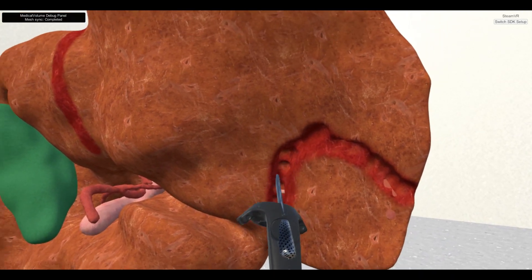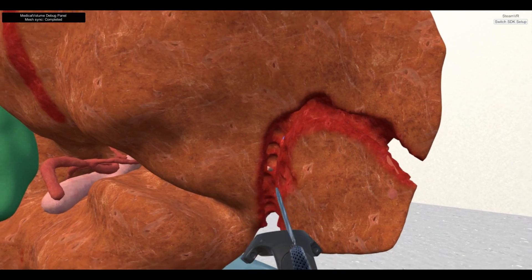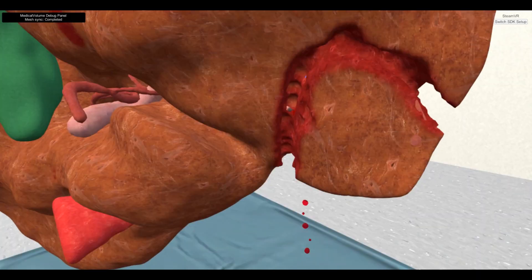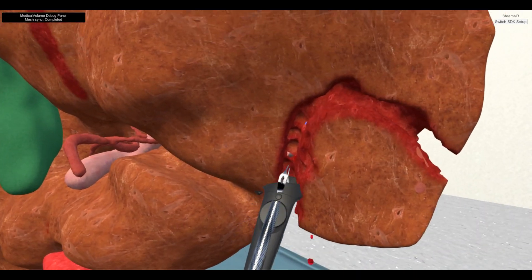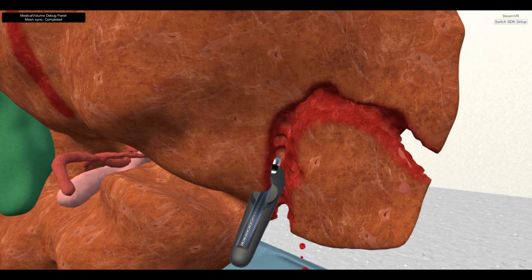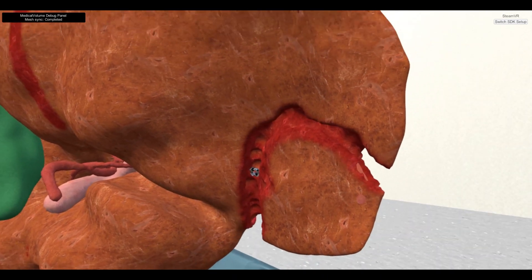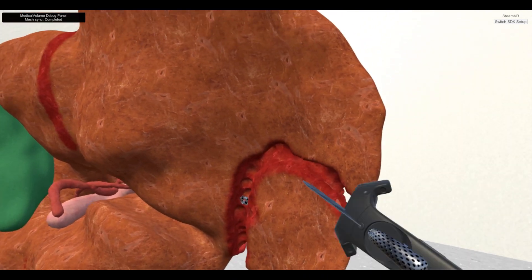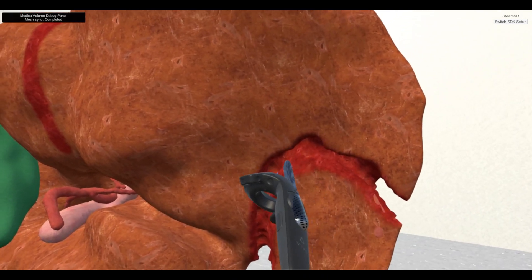The bleeding simulation will also occur if the virtual knife collides with one of the vessel's mesh, and its position will synchronize with other users. To stop the bleeding, the user can employ the left Vive controller with the clipping tool to clip on that vessel.